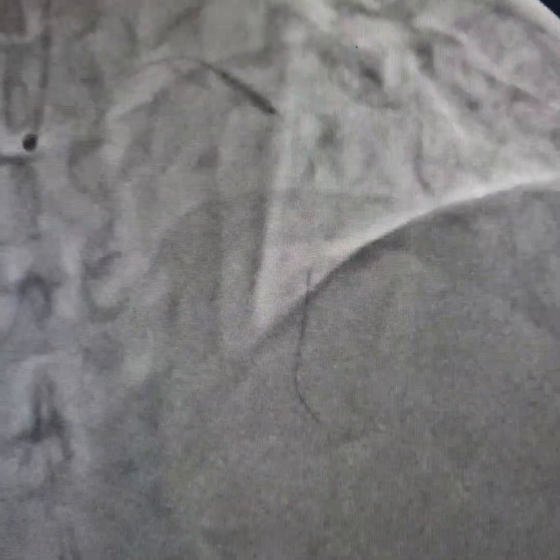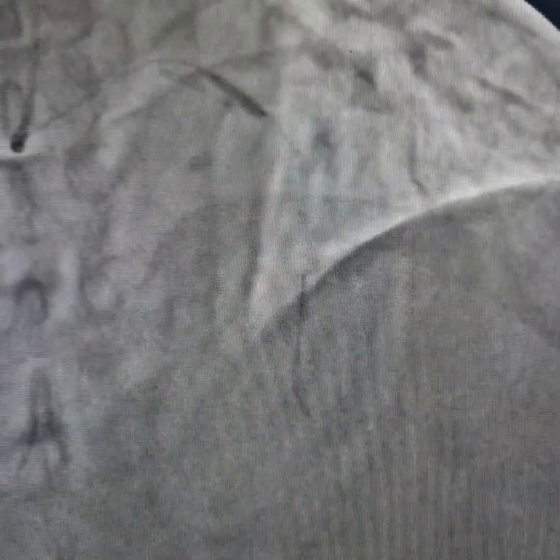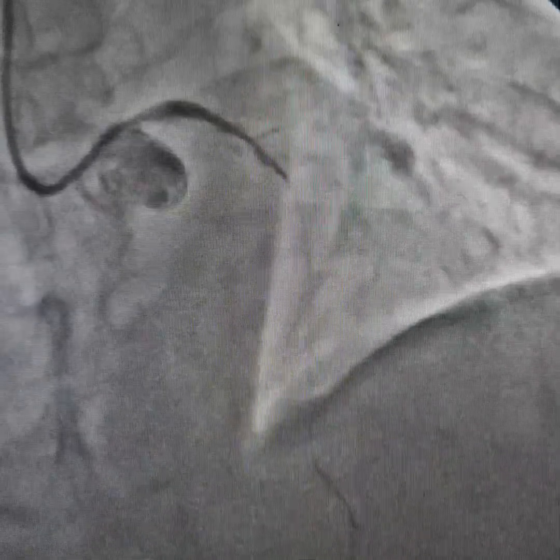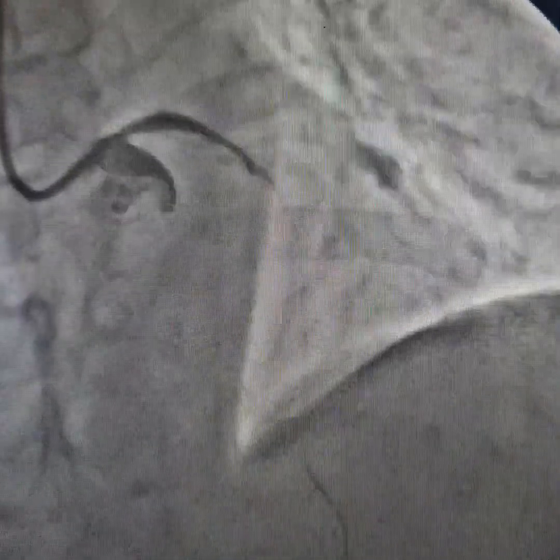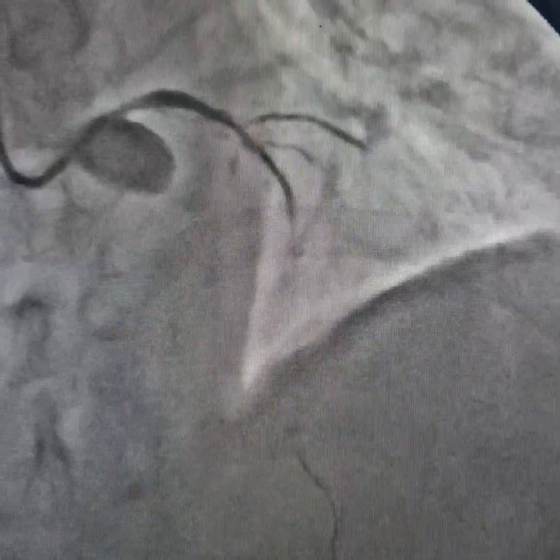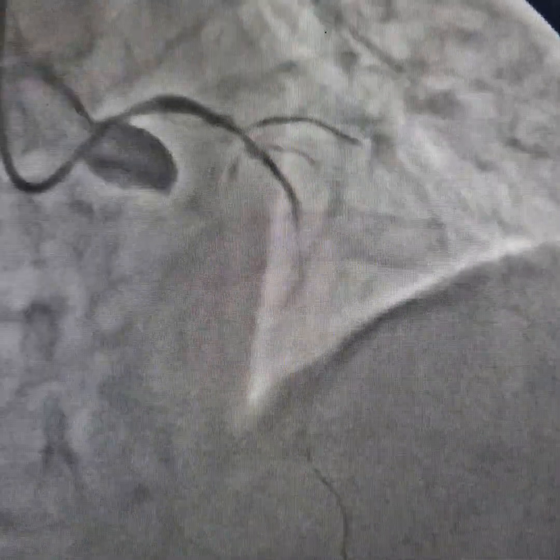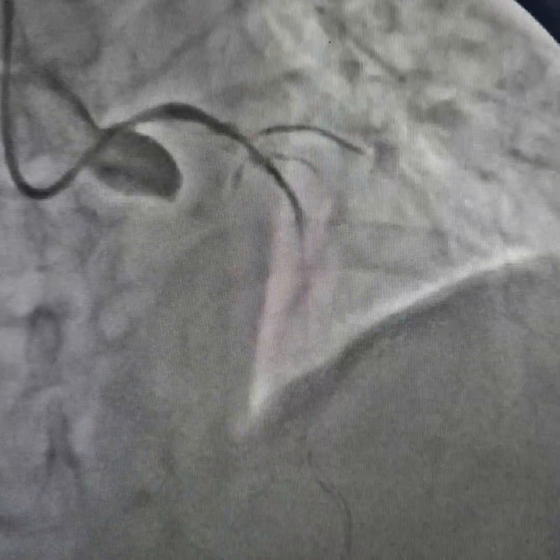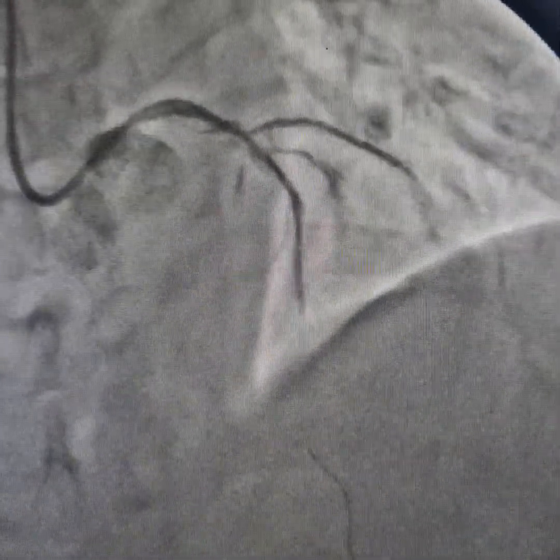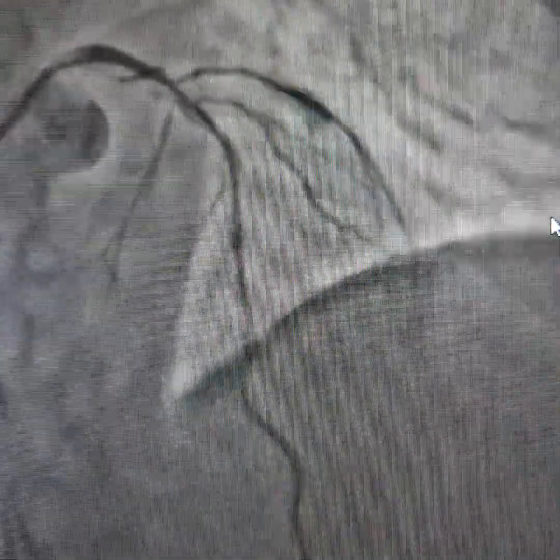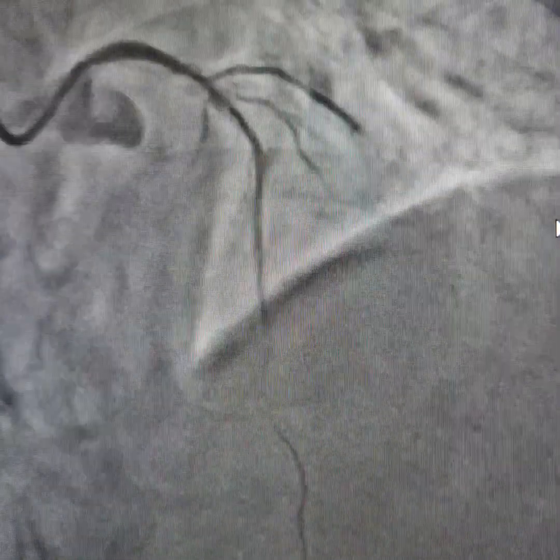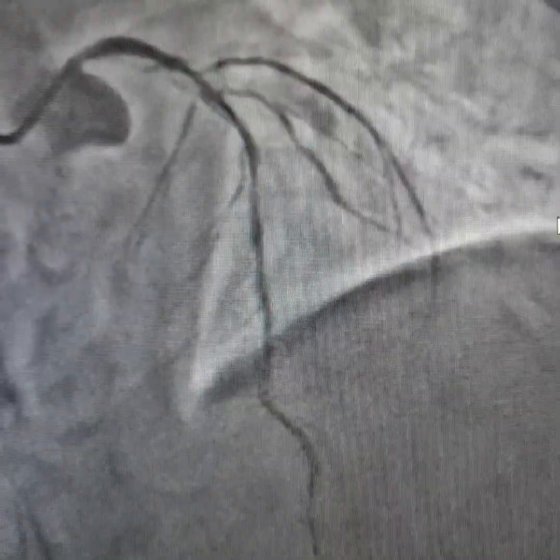Adequate pre-dilatation to show that the stent can expand is very necessary — it is a prerequisite when dealing with a high level of calcium in the artery. You can see that there is slow flow and the patient developed chest pain again. It was quite bad, probably because of the dissection induced by the upsized balloon we had to use to break the calcium — otherwise the stent won't expand. After some nitrates and nicorandil, we can see there is a dissection flap and the flow has been restored.